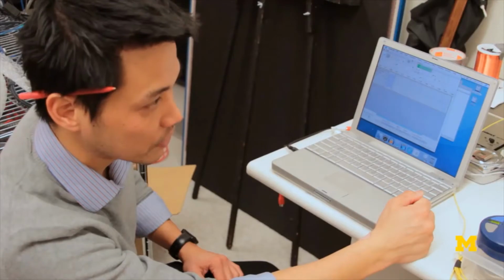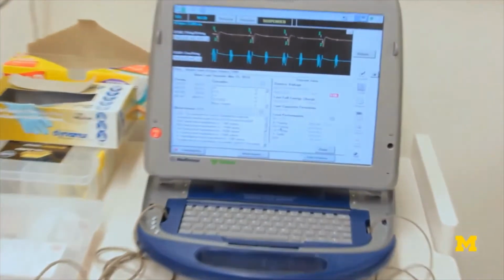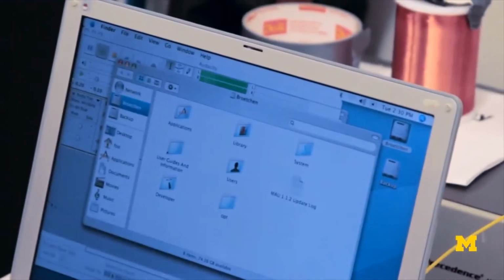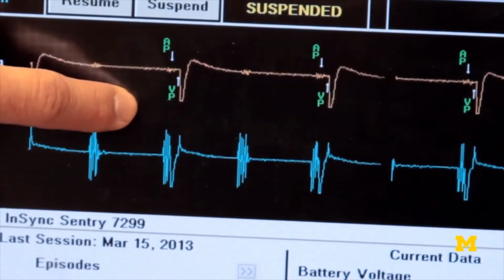All electronic devices emit different kinds of electromagnetic interference, and they can interfere with medical devices. The researchers found that they could use radio interference to send false heartbeat signals to the devices in controlled lab conditions. Theoretically, a false signal could inhibit needed pacing or cause unnecessary defibrillation shocks. Experiments show that this would be very difficult to do in the real world, however. Researchers say patients with these devices can be confident that their implants are safe.